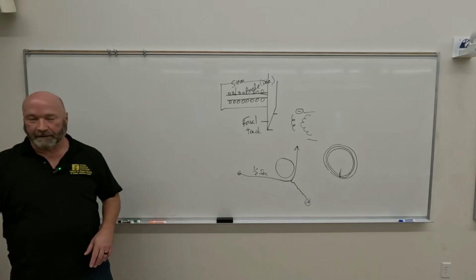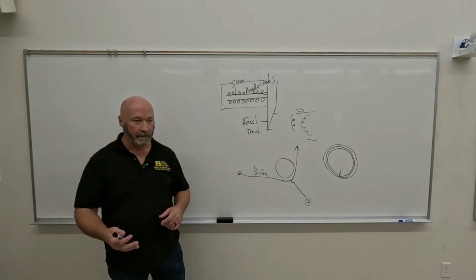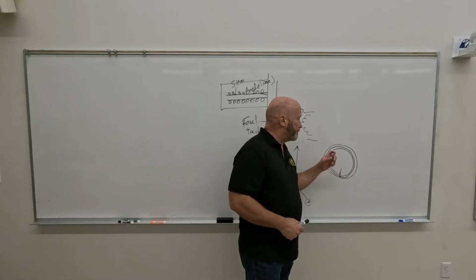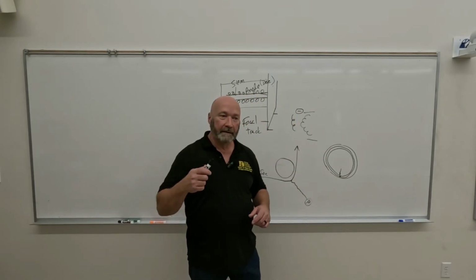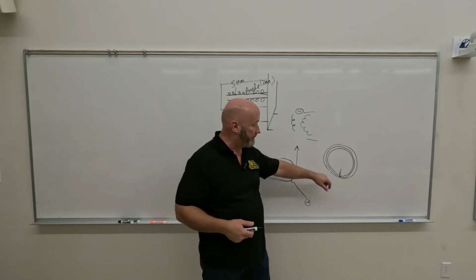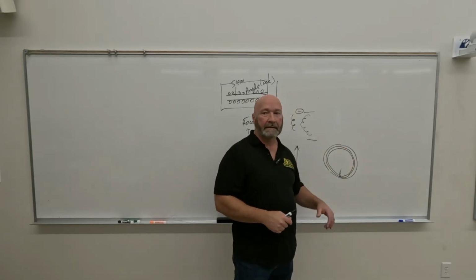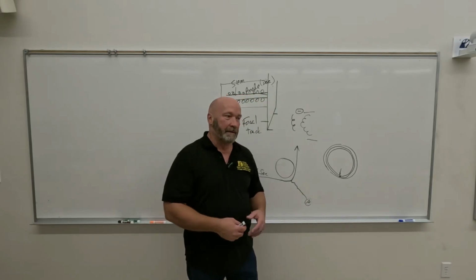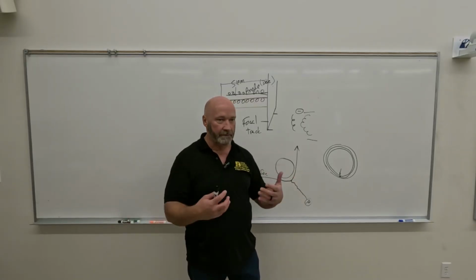The disc that I passed around on Friday, I think, was all tungsten. Not all of them will be all tungsten, for a couple of different reasons. One is tungsten's heavy. You felt that anode, right? The heavier something is, the harder it is to rotate. So what they might do is make the focal track, and that's just the area of bombardment, out of tungsten, and embed it into a lighter material. It still has a high melting point, and it still has good conductivity where the heat will spread out.